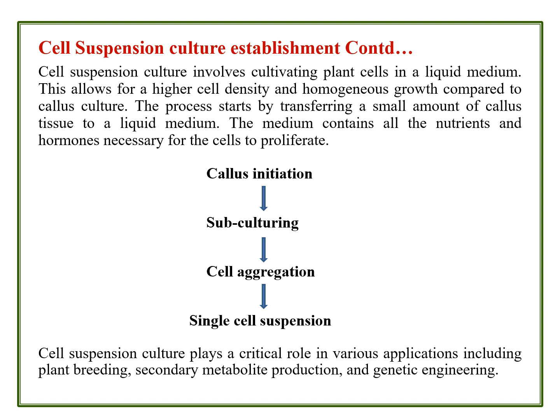aggregated callus cultures. Here also callus should be initiated with an increased concentration of auxin, followed by subculturing of the callus, and then each subcultured part is influenced to form cell aggregates on the same medium supplemented with auxin rich, and then the cells are disintegrated and single cell suspensions are maintained in the liquid culture medium.